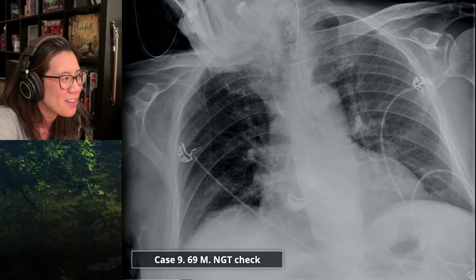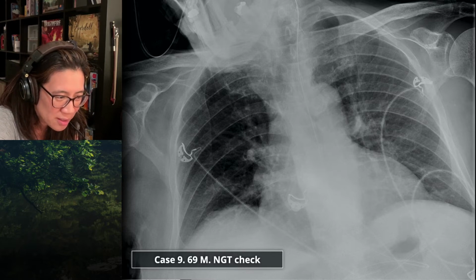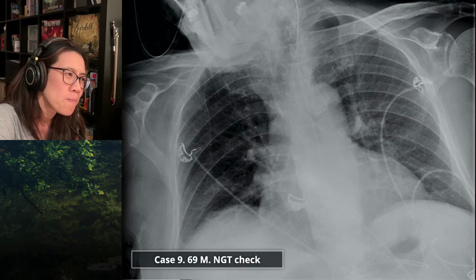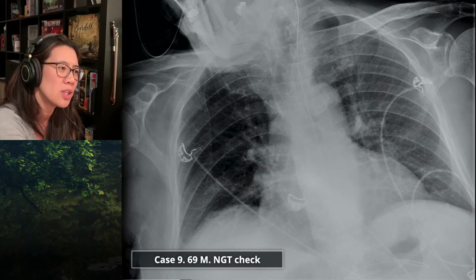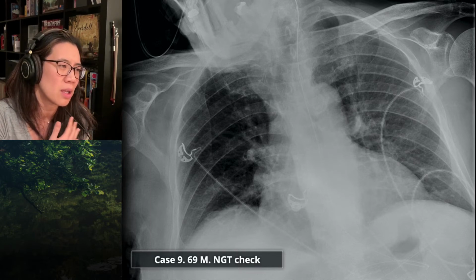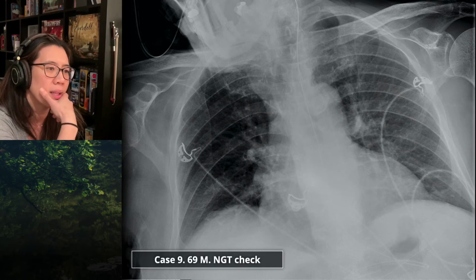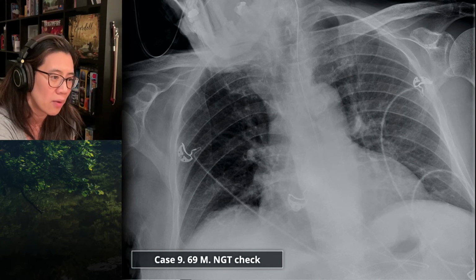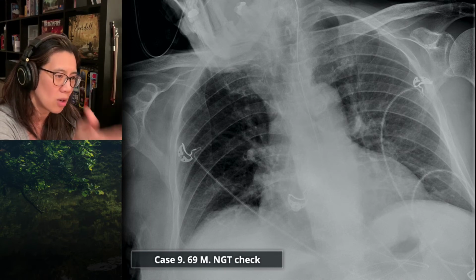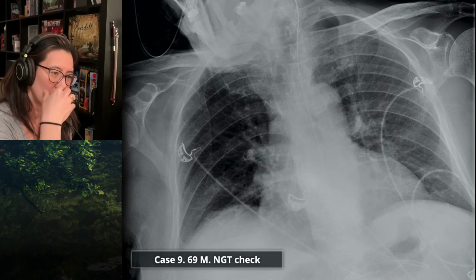Frontal chest radiograph in a 69-year-old male, performed for the purposes of checking the nasogastric tube, which I think is in the right place. So it's quite a rotated film, is my first comment. And I think he's probably rotated with the left chest wall more anterior than the right side. There's asymmetric density in the lungs, with the left lung appearing more dense than the right, but you're going to ask me the question, which is the abnormal side, because the lung volumes look relatively symmetric.